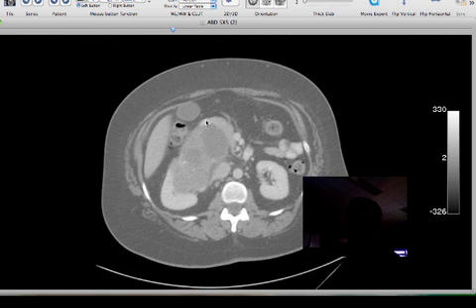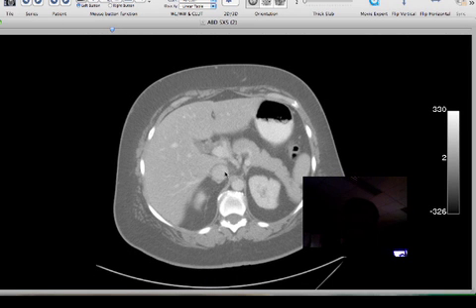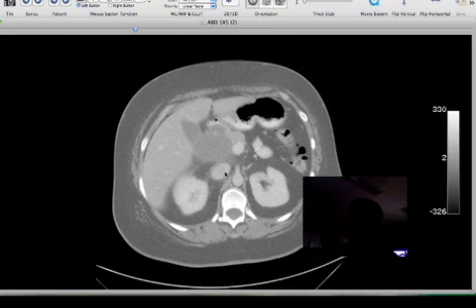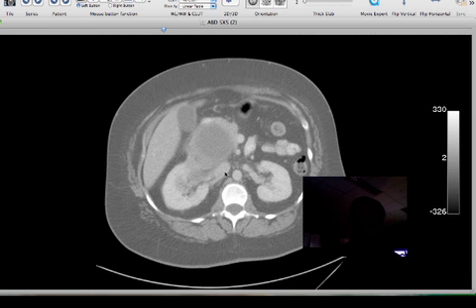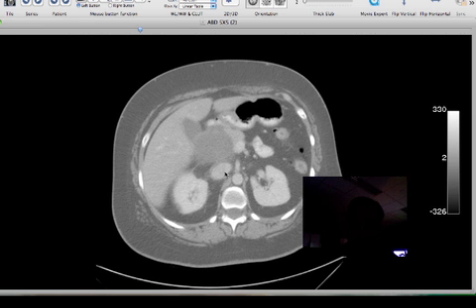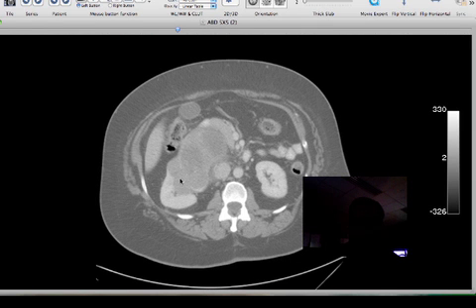The portion of the duodenum that's displaced here, the second portion of the duodenum, is retroperitoneal. The pancreas is retroperitoneal. The kidneys are retroperitoneal. The abdominal aorta and IVC are retroperitoneal. So it's important to understand the anatomy because it will help you identify where the structures are arising and what kind of abnormality you're dealing with. So knowing these spaces is critical here. So this is a retroperitoneal mass arising from the kidney and extending up and displacing the duodenum.